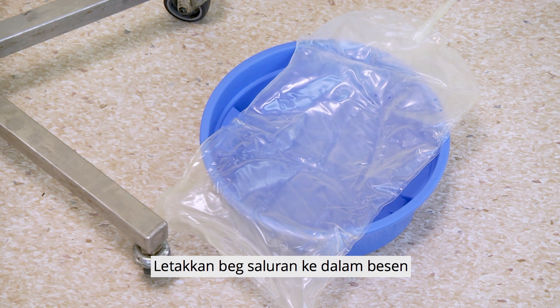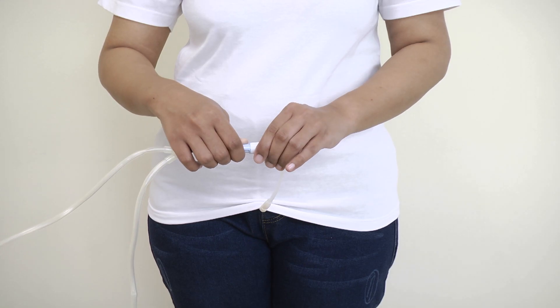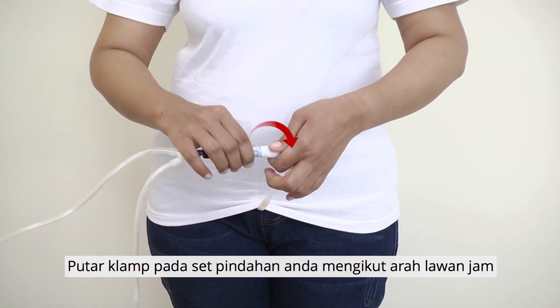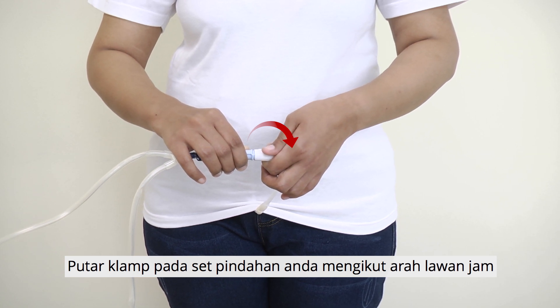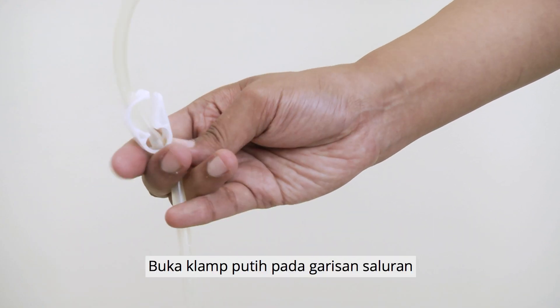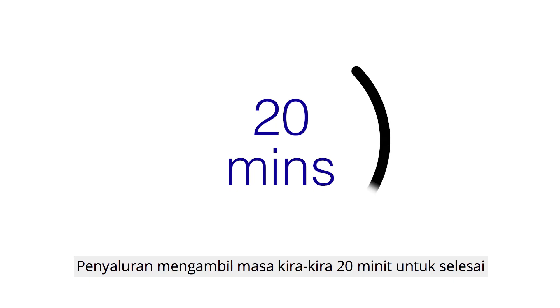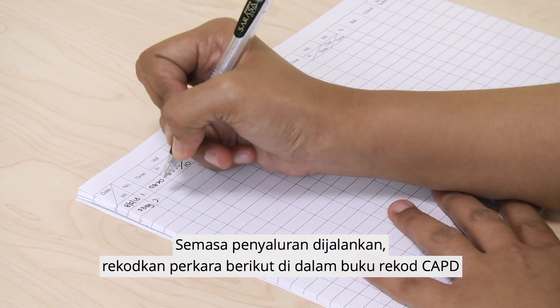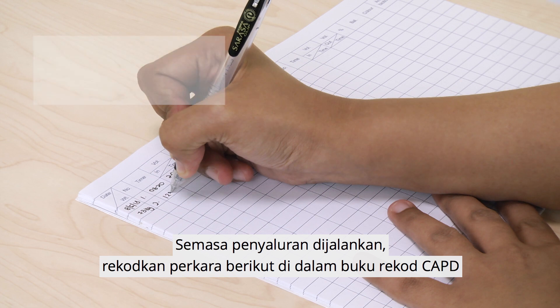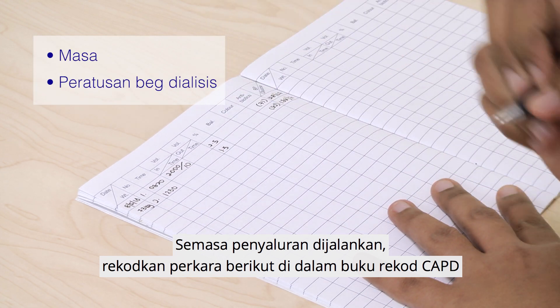Place the drain bag into a basin. Draining. Open the twist clamp on your transfer set in an anti-clockwise direction, then open the white clamp on the drain line. Draining takes about 20 minutes to complete. While draining is taking place, record the time and percentage of dialysis solution in the CAPD record book.